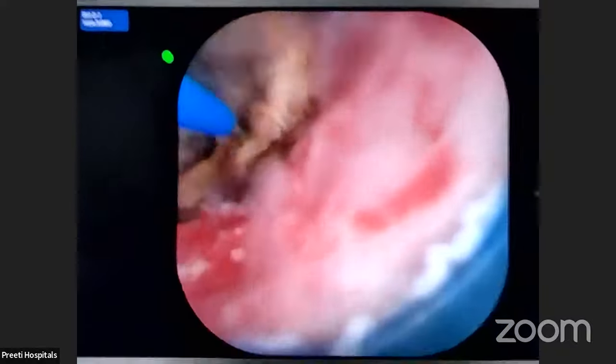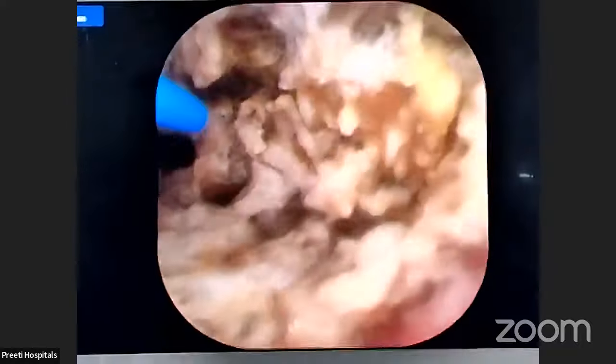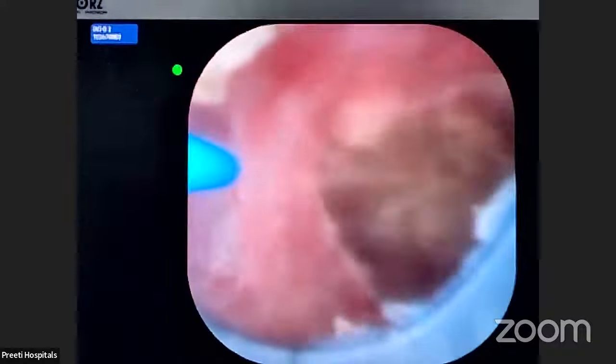This stone can be done with URSL and laser, no, sir? No. That is totally wrong. With RIRS only, I am bending so much. You are not understanding. Those people who are doing URSL for kidney stones are totally missing out by not learning RIRS. That is not correct. You can never give 100% SFR because you cannot bend. So much I am bending inside.